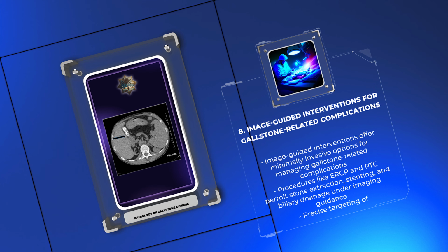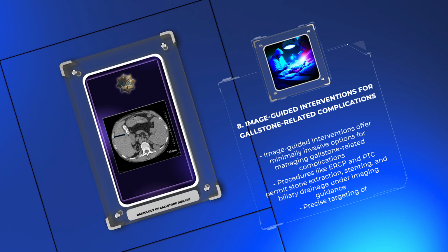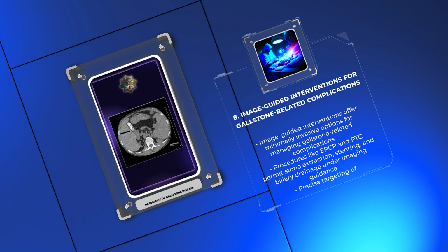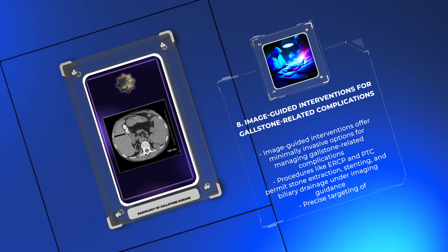Professor, procedures like ERCP and PTC permit stone extraction, stenting, and biliary drainage, all under the guidance of various imaging modalities. By utilizing fluoroscopic or ultrasound guidance, radiologists can precisely target the gallstone-related complications and provide effective treatment while minimizing surgical interventions and associated risks. Scene transitions to the title of the next topic.